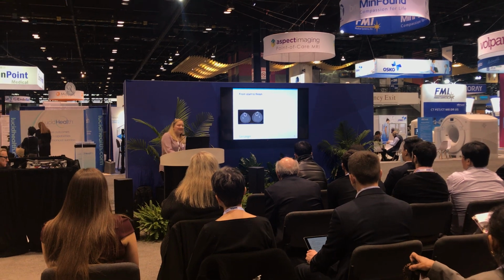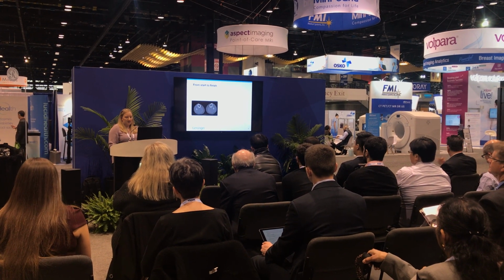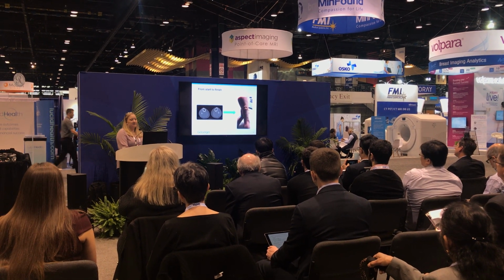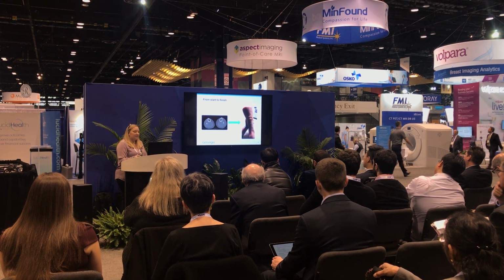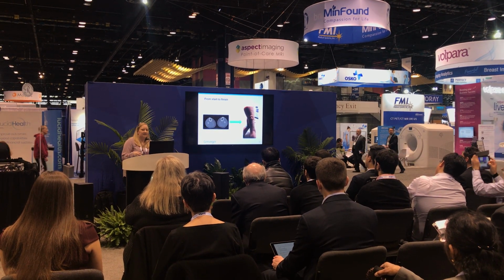So the easiest way to just explain what I'm doing is to show you one model from start to finish. So literally from the CAT scan to the model we did. So this is a lower leg traumatic wound that I simulated. It has 3D printed tibia and fibula, muscle, fat, and skin layers for different Shore values, and that skin is suturable as well.